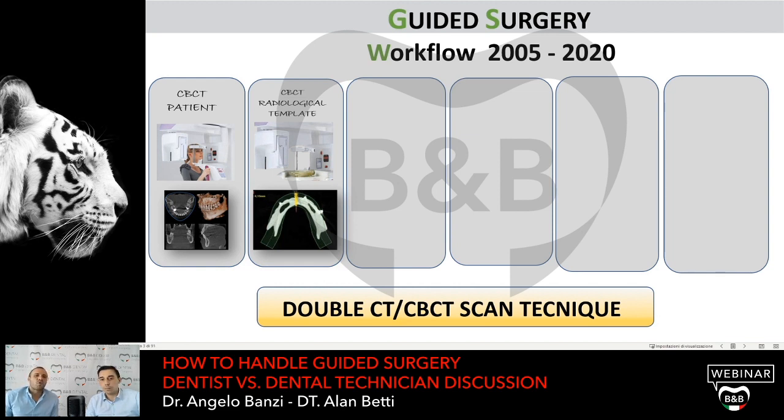So I ask my technician for a new prosthesis that matches occlusally, I mean, in the right way, and I'm going to use that prosthesis as a radiological template. But if the prosthesis of the patient is well done, I can even use that prosthesis as a radiological template. I don't need any copy or a new prosthesis.